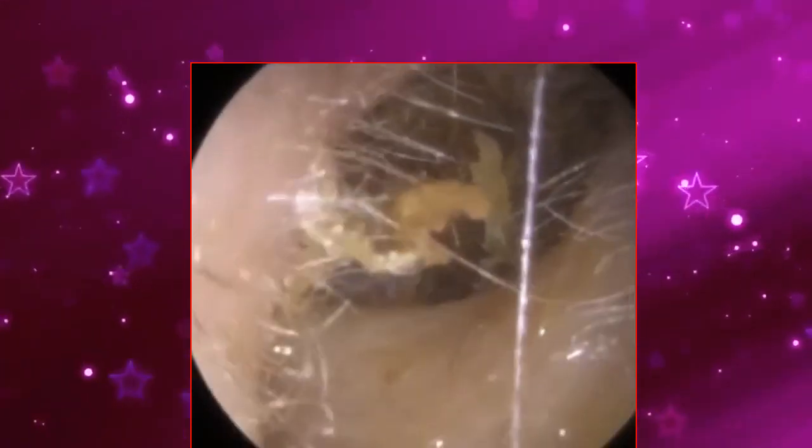Grade 4 is the most serious. It can significantly widen the ear canal. You can get a lot of bleeding underneath the skin plug because it's compressed against the canal walls. When you remove it, there's a lot of blood formation. Sometimes a grade 4, because it's so painful, would need to be surgically removed.